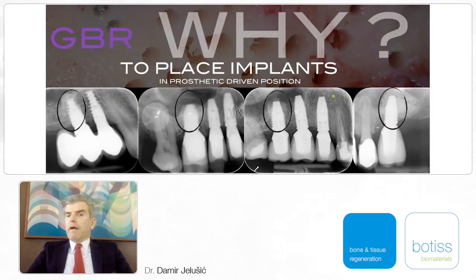Implants are today, let's say, the most important topic in many dental practices, and GBR is always connected with implant placement. So why are we doing GBR in most cases? To place implants in a prosthetic-driven position. The time of positioning implants where the bone is, is past.